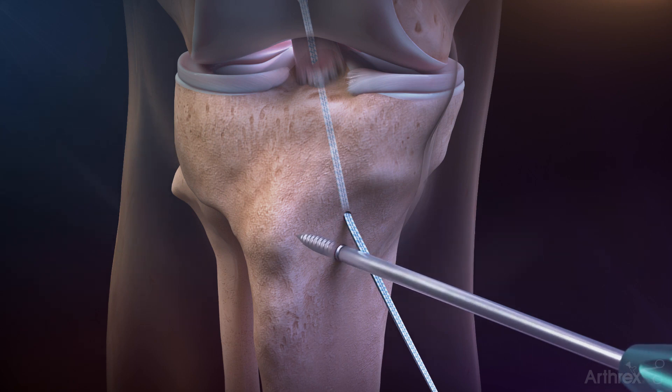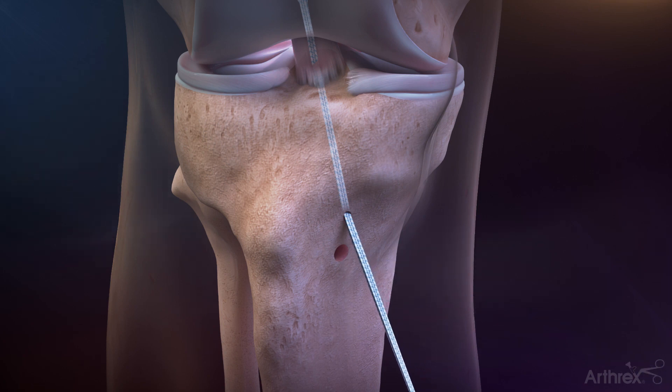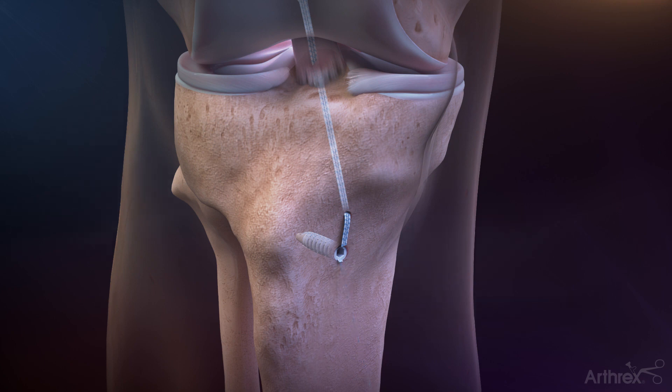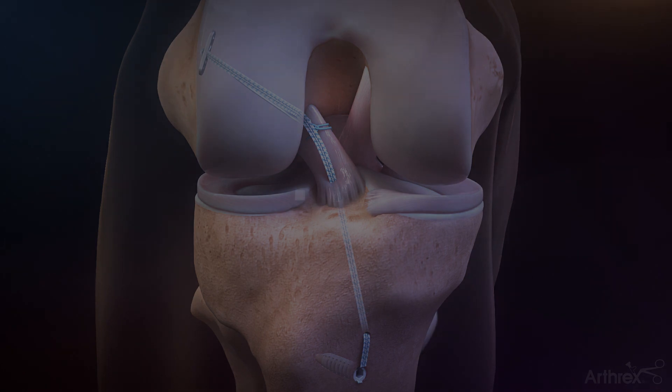Use the included 5.2 millimeter tap to tap the pilot hole. Fix the fiber tape using a 4.75 millimeter swivel lock anchor. Put the knee through a range of motion and re-tension the ACL repair tightrope tensioning sutures to confirm final construct tension and complete the repair.